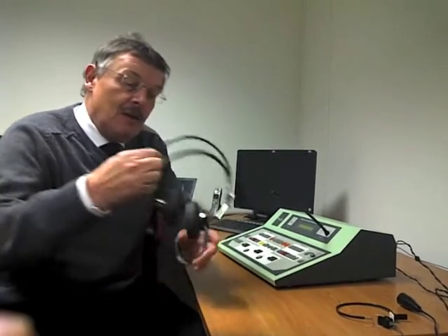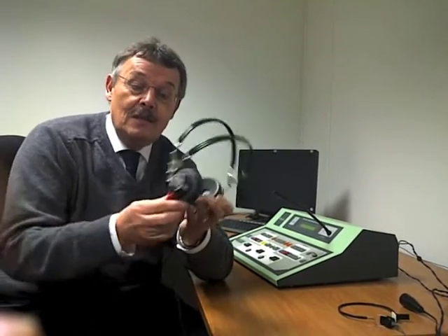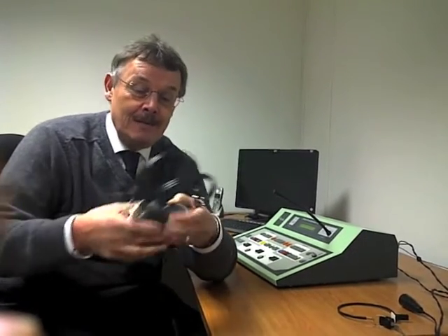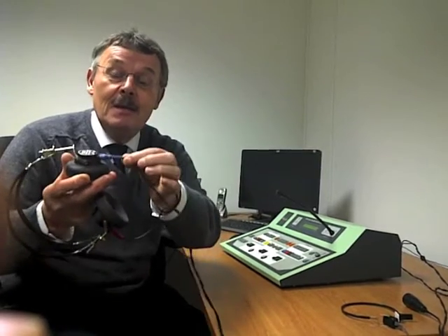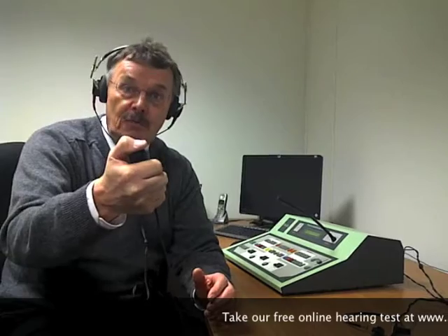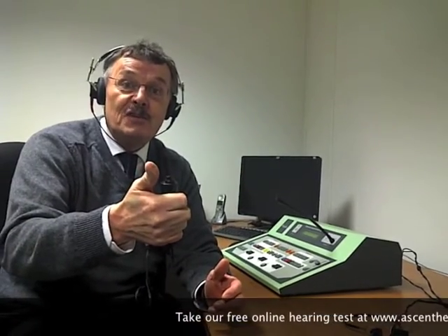This test is normally carried out using headphones that isolate the right ear from the left ear. So a signal is directed into this red phone, which is conventionally put on the right ear, separately, and at a later time, the blue phone, which is put on the left ear. So basically, the client is fitted with headphones, they're adjusted to comfort, and then they listen for the test tone in the right ear, from the 250, the 500, the 1,000, and if they hear it, they press the button, and if they don't hear it, obviously they don't respond.